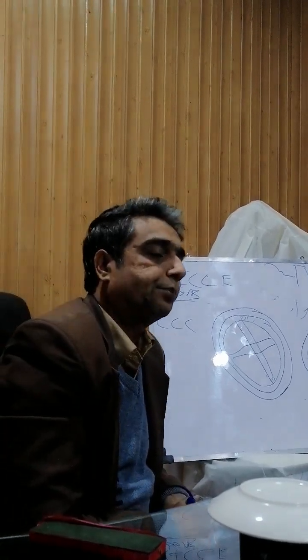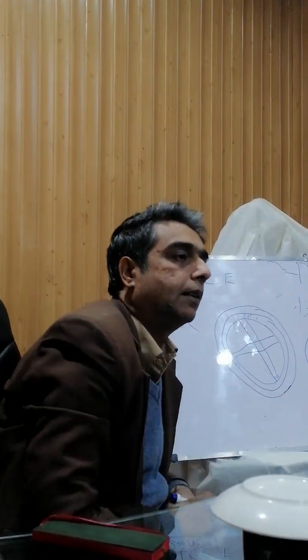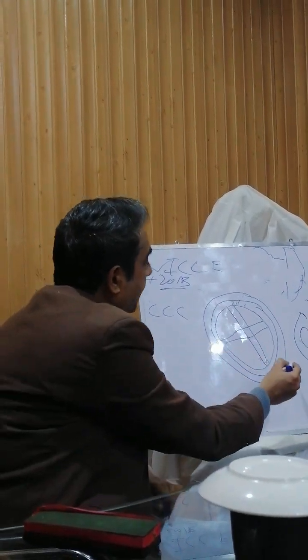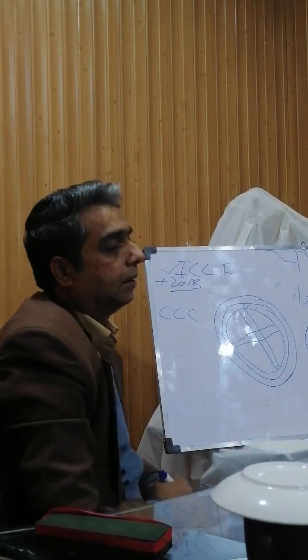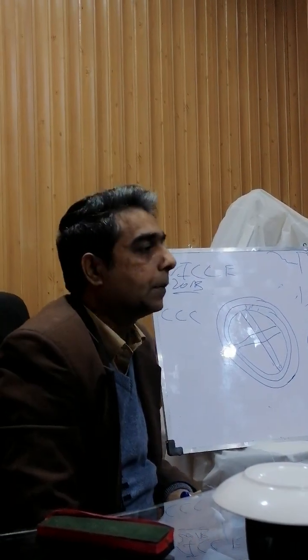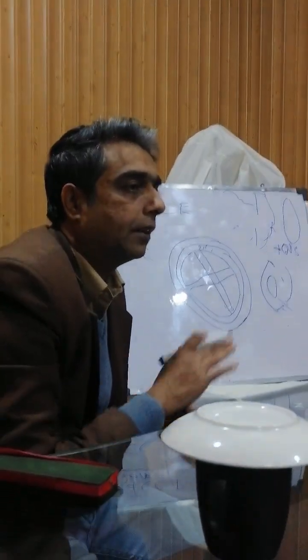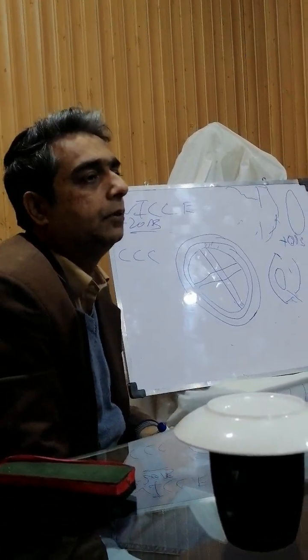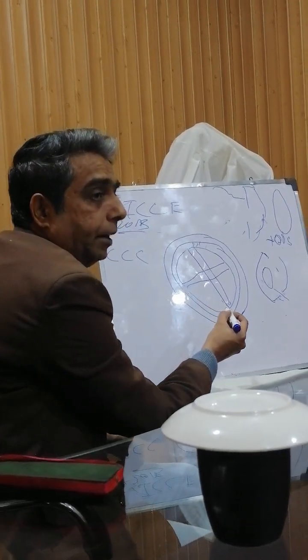Phacoemulsification is basically a refined form of extracapsular cataract extraction. Here also the key of the surgery is to preserve the posterior capsule. If the posterior capsule is gone, then your surgery is gone. You are out of extracapsular cataract extraction. Then there are other modalities which you will have to perform. So, are you getting my points?